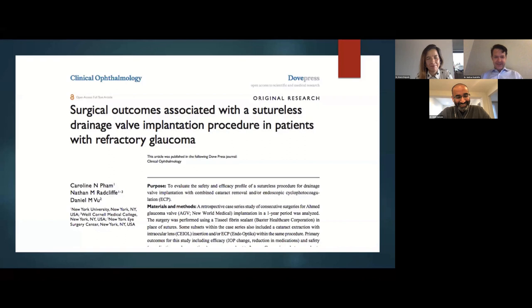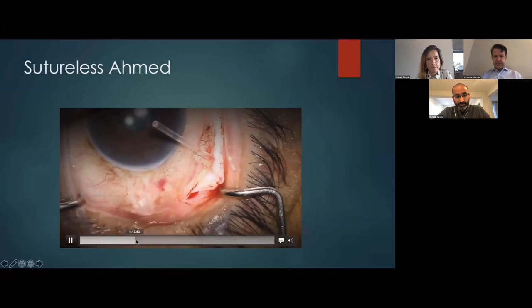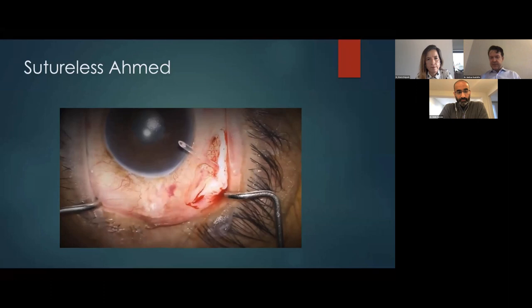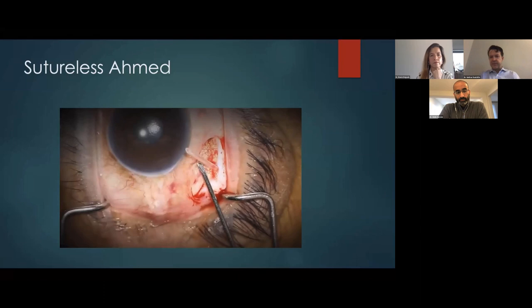Oh, what did I do? I'll go back to that. Okay. So we're right here. And okay. So the tube comes in, and I'm angling a little bit here. Always go bevel up. If I'm going into the sulcus as a plan, I might reverse it. And that depends on whether I think there's vitreous in the sulcus or not. If I think there's vitreous in the sulcus, I keep a bevel up. If I know that I did the cataract and there's no vitreous, I'll go bevel facing down to avoid the iris. I have viscoelastic in this needle.